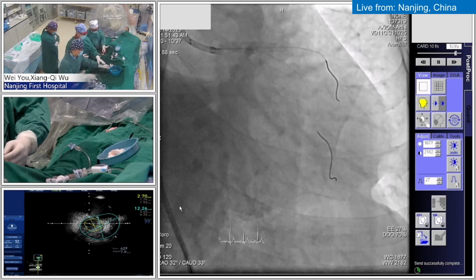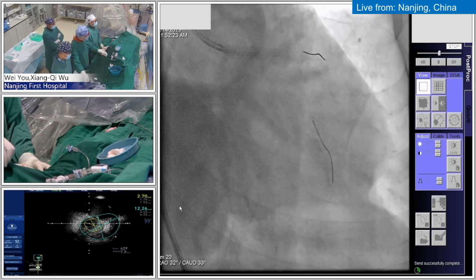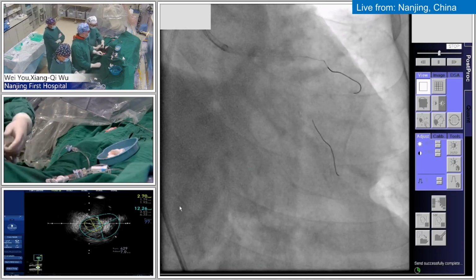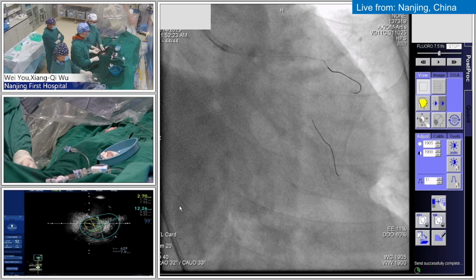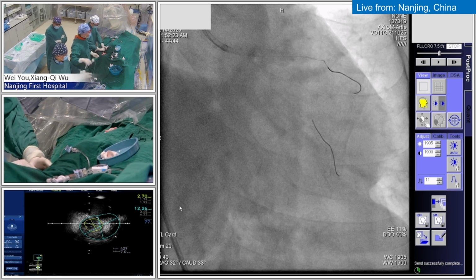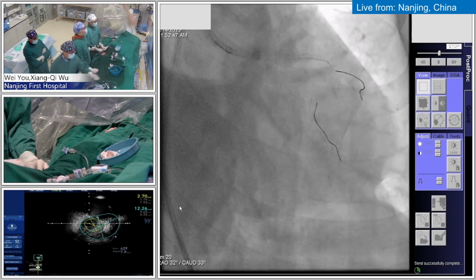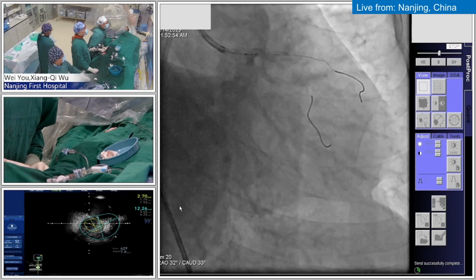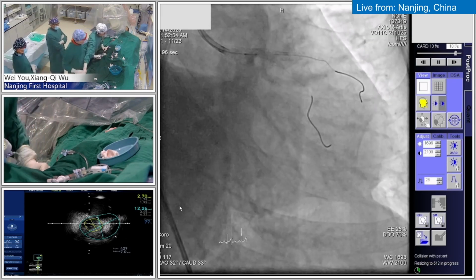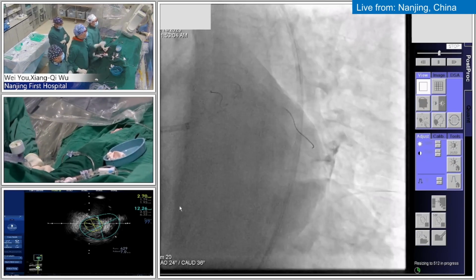I don't think that is a coincidence. I think these kind of things are probably because of the format which we have very carefully thought through with Medstream 360, that once you have true world experts, you don't want them to be having excessive guidance. I mean, if Dr. Sharma at Mount Sinai is doing a complex left main bifurcating case and is having challenges with the rotational ablation, I don't think another expertise is needed to guide him. Often all that is needed is an unrushed environment, a calm aspect, and that is what I think the live case at Medstream 360 provided us.